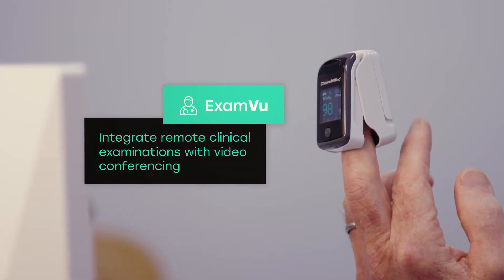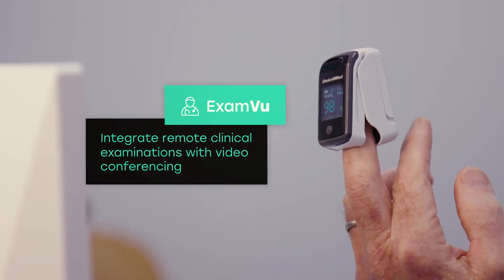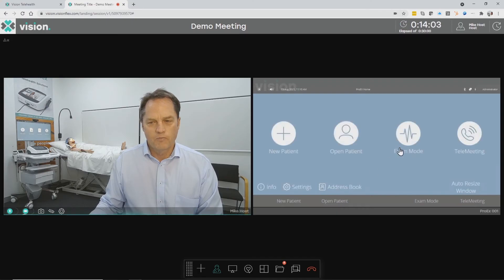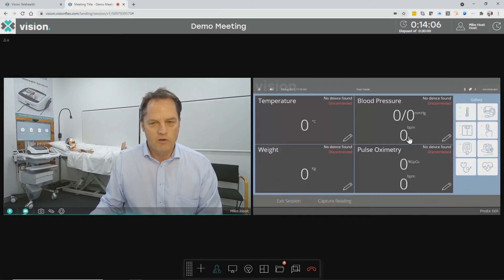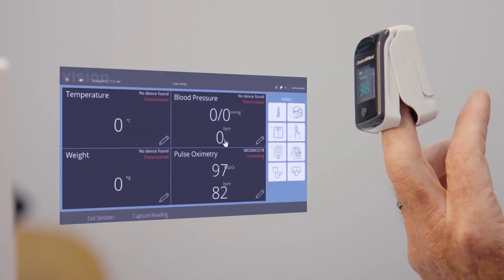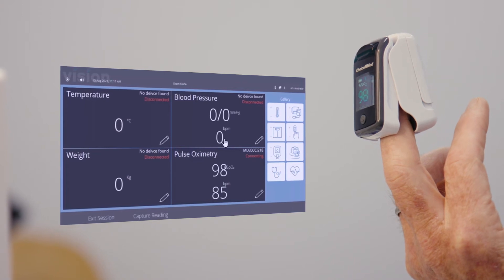ExamView allows the local health professional with the patient to take a series of readings or measurements using instruments such as blood pressure, pulse oximetry, blood glucose, ECG, temperature, weight and so forth. All of these readings come into the system and are uploaded automatically to your electronic health record system.